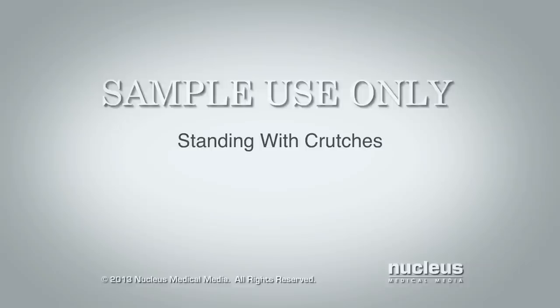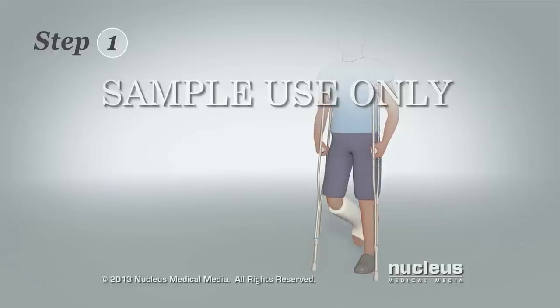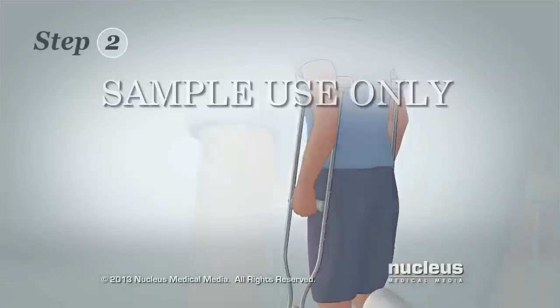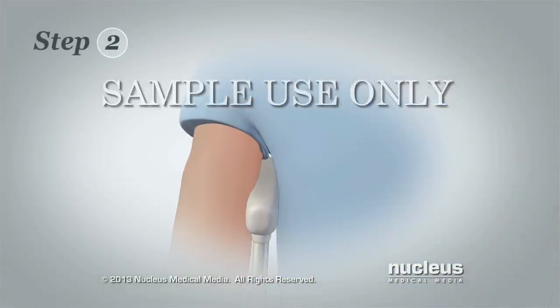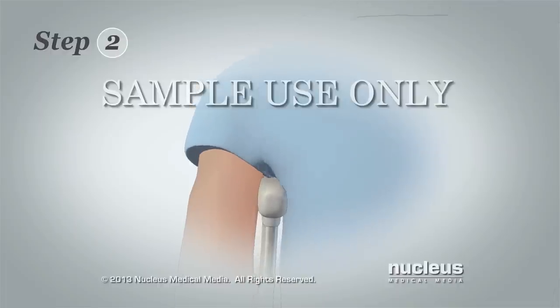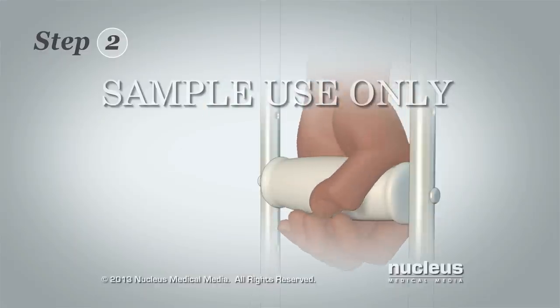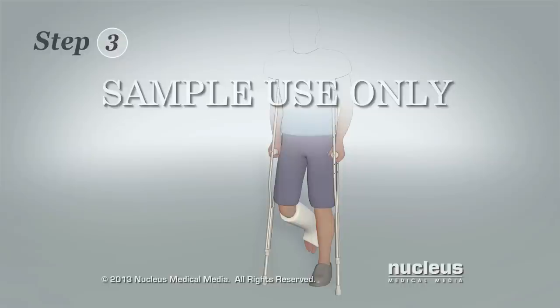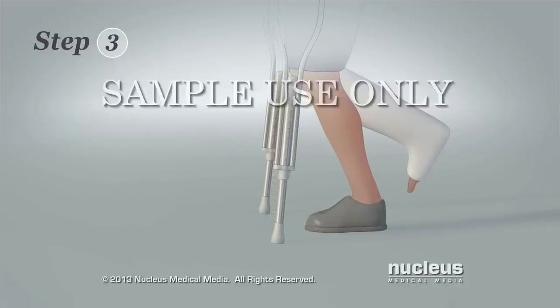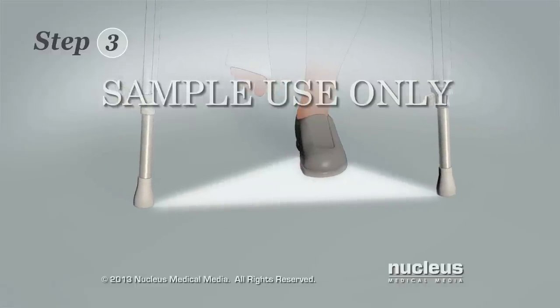You'll learn how to stand with crutches. Step 1: While standing on your uninjured leg, hold one hand grip in each hand. Step 2: Squeeze the crutch pads between the sides of your chest and upper arms. Do not rest your armpits on the crutch pads to support your weight. You will support your weight on the hand grips. Step 3: Spread the crutch tips apart and put them slightly in front of you on the floor. This is called a tripod or three-point stance.